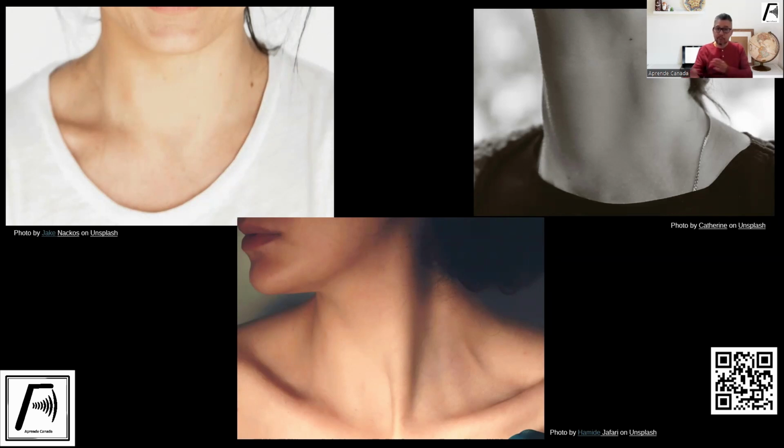So the idea is that you ask the patient to change the position of the head, and by doing that, you're moving that shadow from the refraction away from your target area, right? But this is going to be a dynamic thing, because you may have to ask the patient to turn the head a few more times.